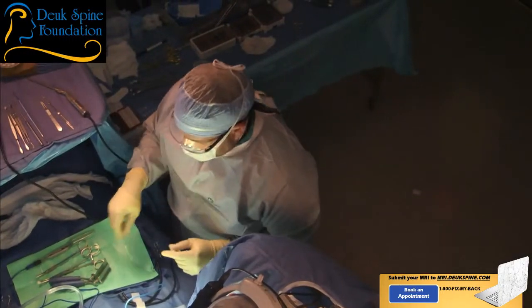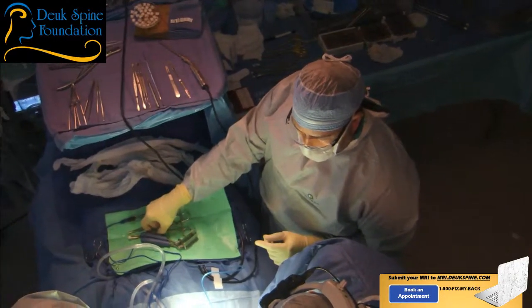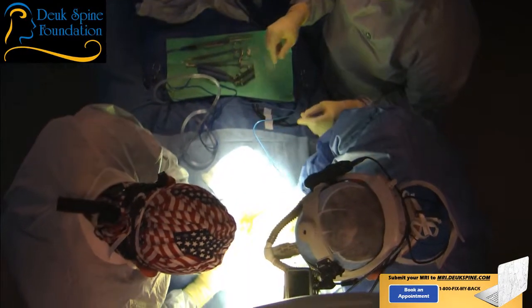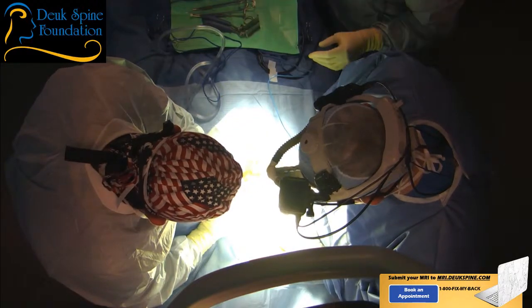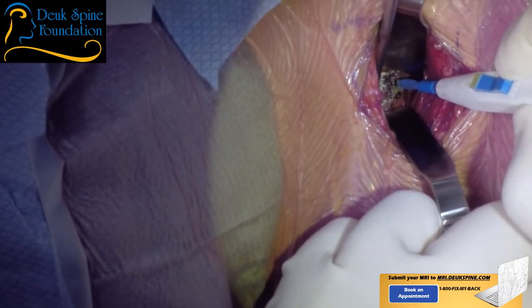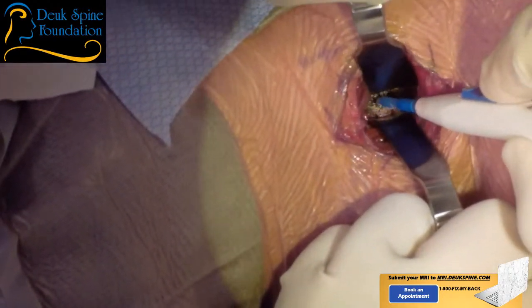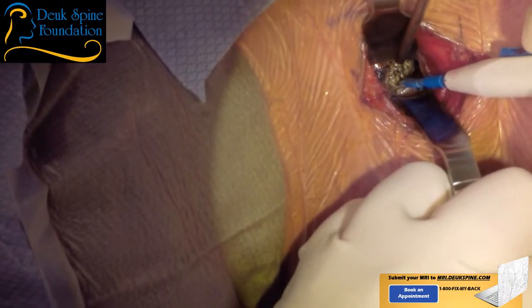This would be the vertebral body of 6. This is the 6-7 disc space. We're only doing one disc today, 6-7. Everybody agree? Okay. Come south. And the exposure needs to basically be the disc itself, which is right here, and half of the vertebral body below, half of the vertebral body above. That's how it works. I need you to protect the esophagus. There you go. Not too much, Dr. Patel. You can ease up a little to me.